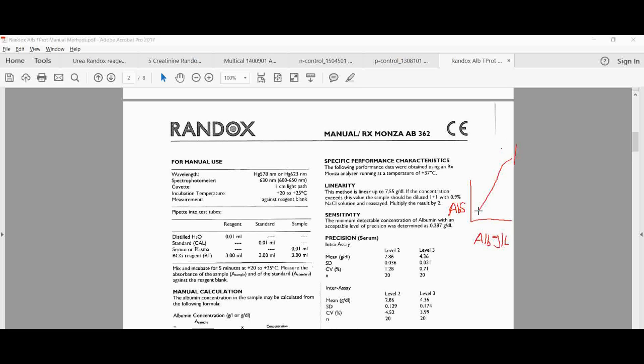And you might get results that differ in extreme conditions. So let's say that result is there, that result is there, and that one there, so you draw a line of best fit.